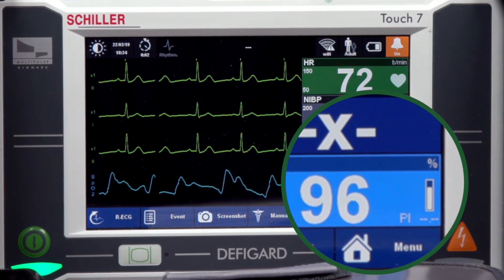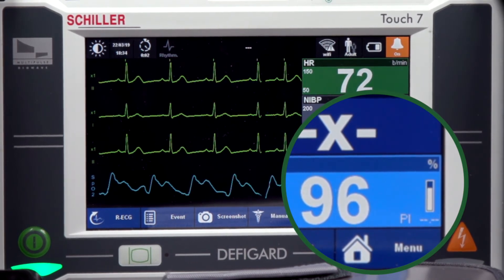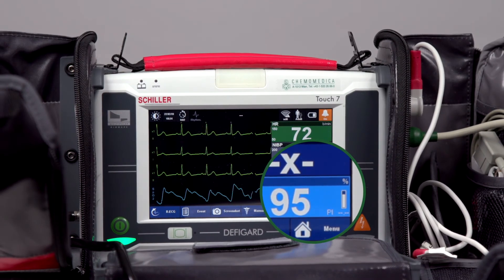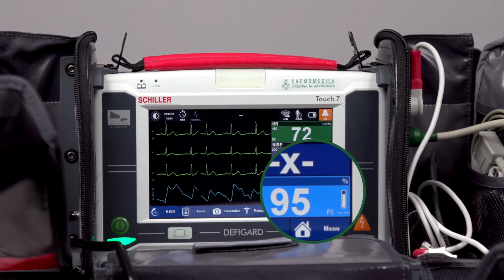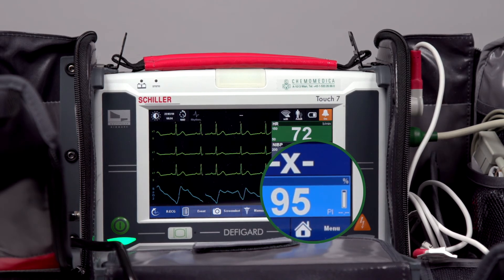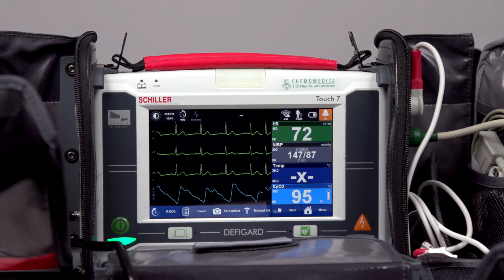If you look at the right-hand corner of the pulse oximetry window, there is an option for perfusion index. Right now it's not registering a number — it takes a little bit longer to present, but that number will appear after a period of time.